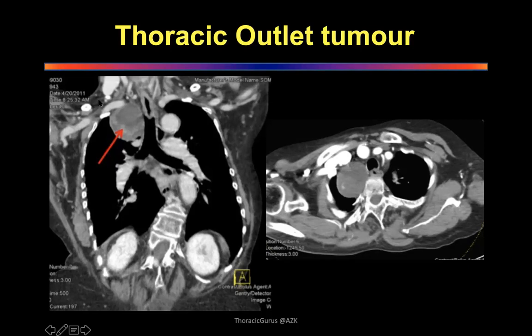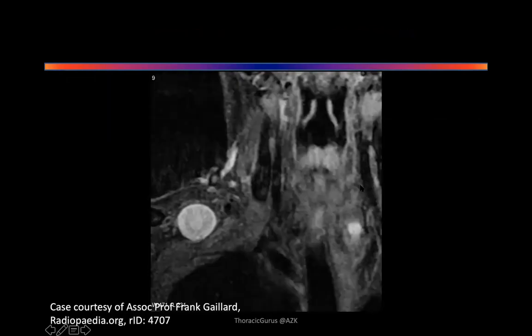We'd like to do a PET scan first, sir. MRI is what you want to do to see whether it's invading into the vertebral column or not. Invading the neural sheath or not. Yes, sir. Well, good. So now what is this? Vikas, continue.